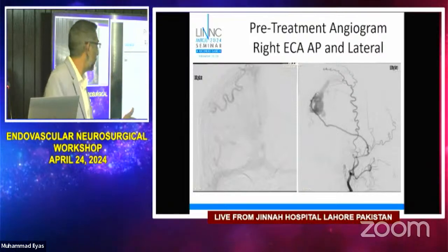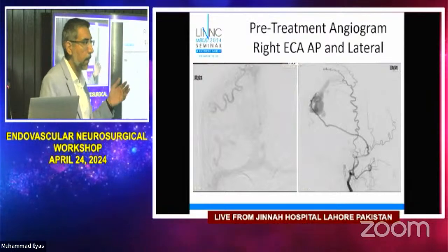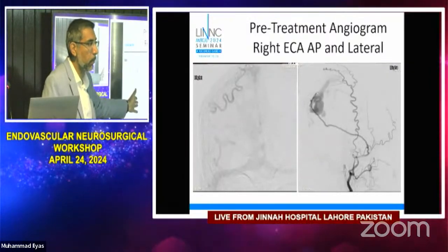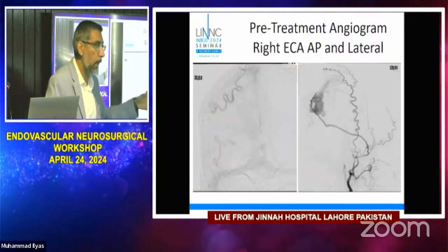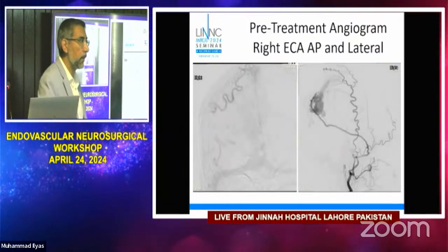So I said, okay, well, I'll take the catheter, I'll inject Onyx. If I kill it, great. If it's not completely cured, I had the OR ready for backup. If it doesn't work, I'm just going to bring him down to the OR right from the angio suite and do the craniotomy. I'll see some Onyx that will help me identify, and then I'll just clip it and resect it and be done with it.